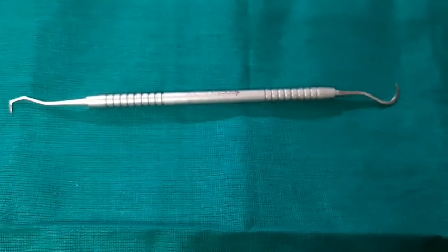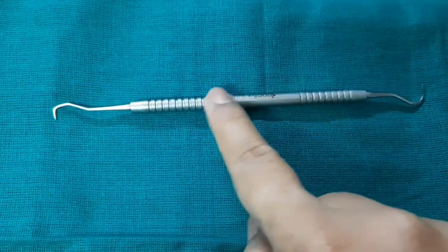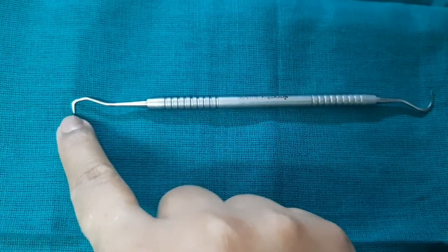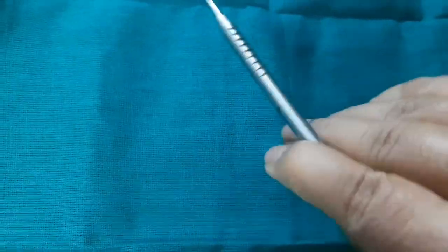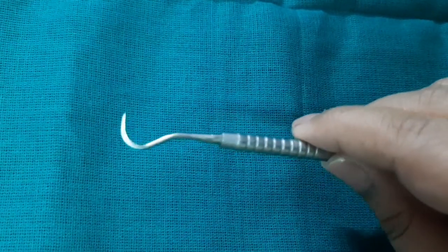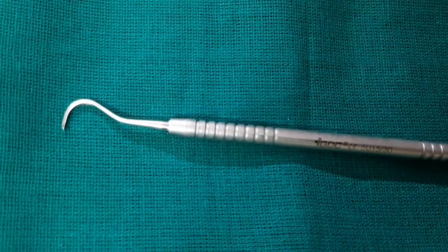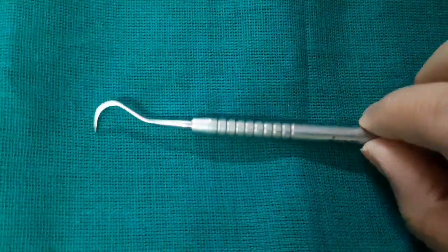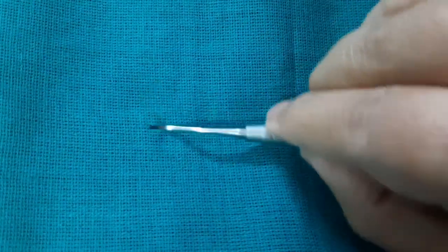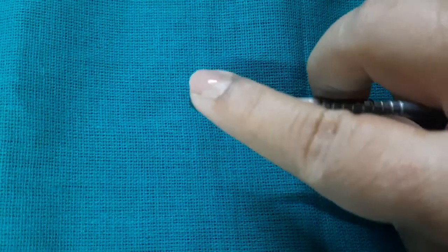Regarding the parts of a scalar: this is the handle, this is the shank, and this is the cutting edge. If you do a cross section of the scalar you can see there is a triangular shape. These are the lateral edges, this is the face, and this is the tip.